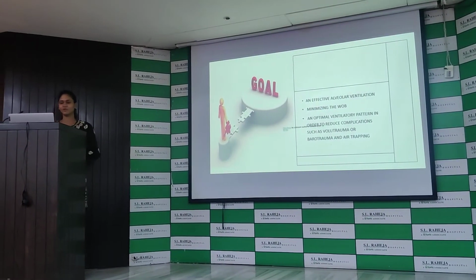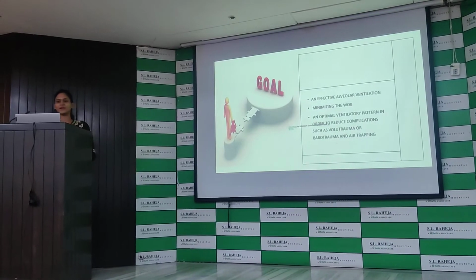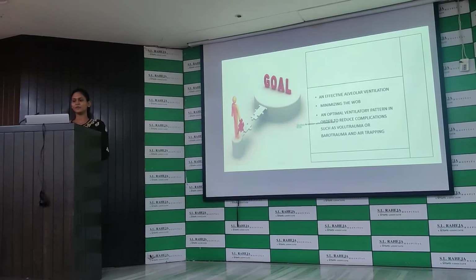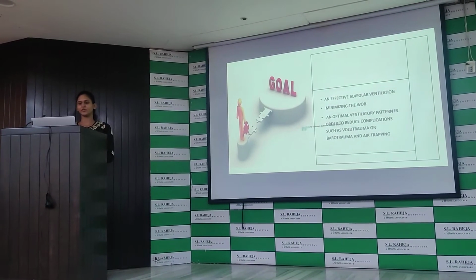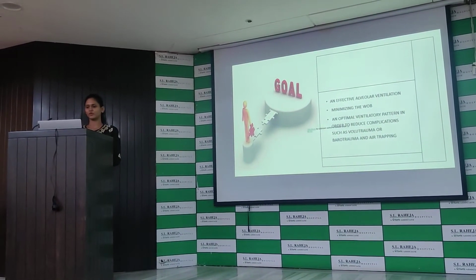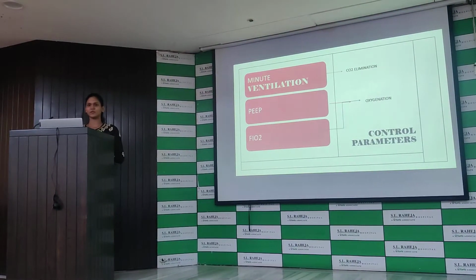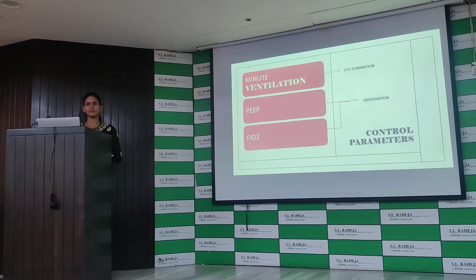So what is the goal of this mode? It is to have an effective alveolar ventilation, minimize the work of breathing, and an optimal ventilatory pattern in order to reduce complications like volume trauma, barotrauma, air trapping. So what do we set, what are the control parameters? Minute ventilation, PEEP and FiO2.